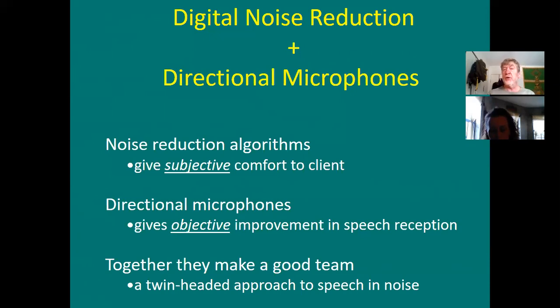Noise reduction algorithms give subjective, heartfelt comfort to a client. They don't increase speech percent of recognition. Directional mics do give objective improvement in speech reception. And together they make a good team. One's the head, one's the heart. One's the science, one's the art. Together they make a good team. Essentially, that's the way to look at it.